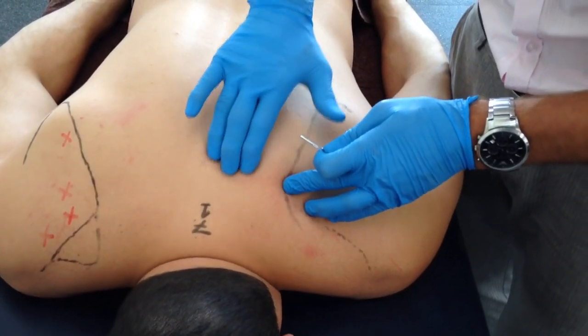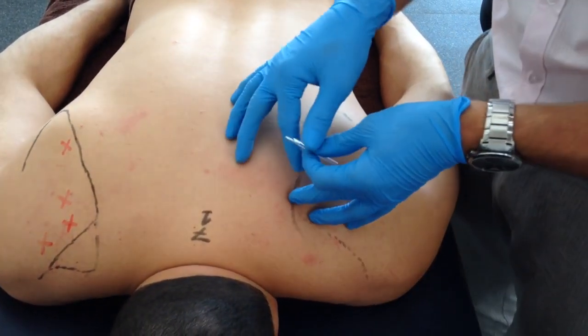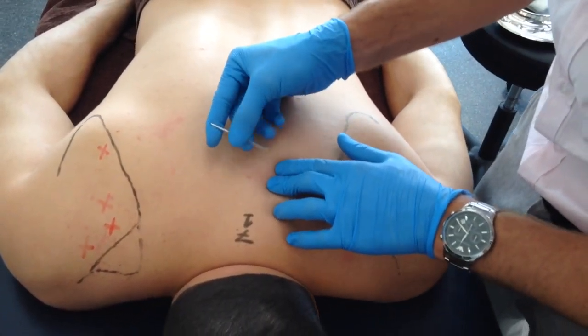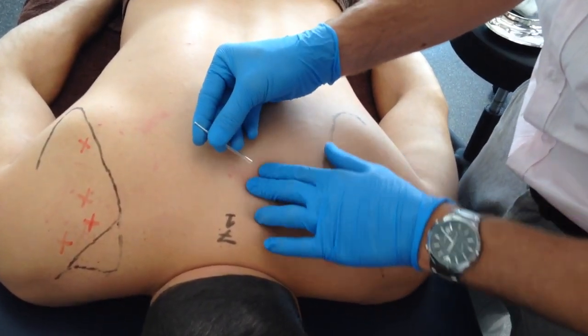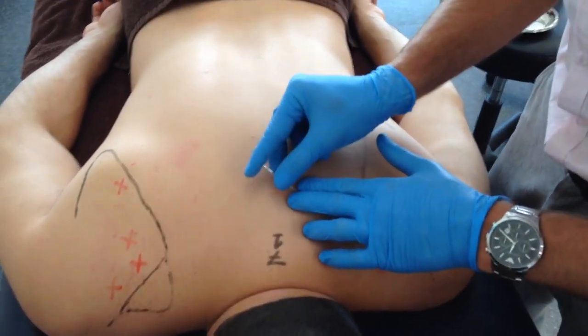Taut bands in the mid-fibres of trapezius should be palpated for and secured with the middle and index fingers over a rib. The area should then be needled in a medial to lateral direction at an acute angle towards the spine of the scapula.